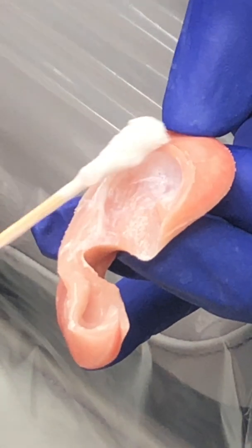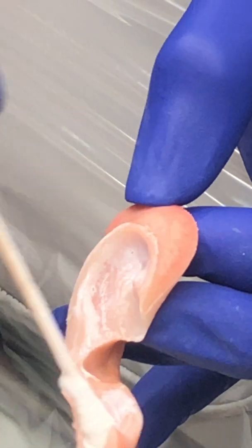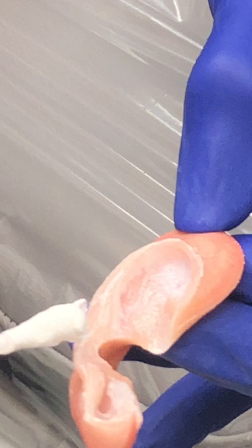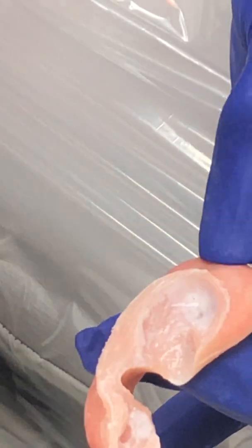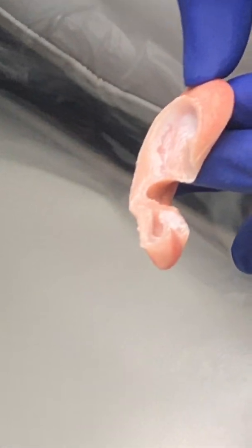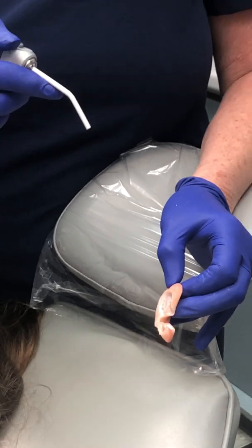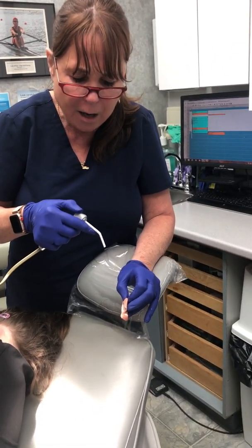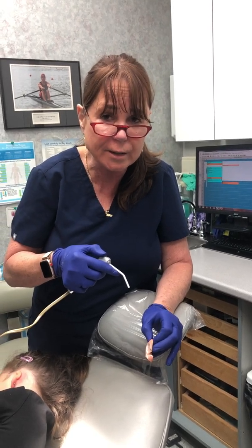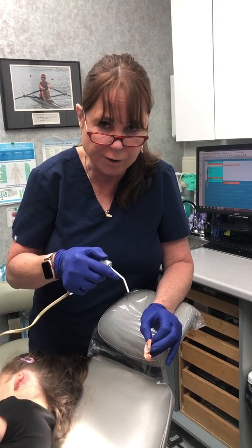You don't want to put any adhesive on the outside of the ear that shows, because it just makes it tacky. Now, this ear is stained inside, so even though the adhesive is on there, to take it off you roll it with your fingers, like when you would remove a piece of rubber cement or a sticker from glass. The color is layered throughout the ear, so it's intrinsically stained. The color will not come off. It will never change color.